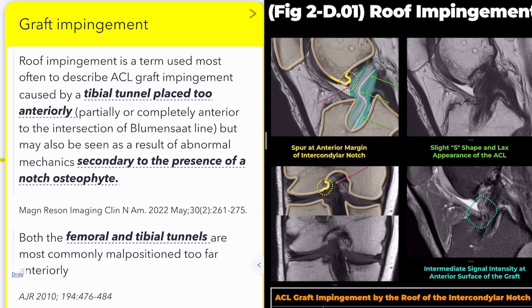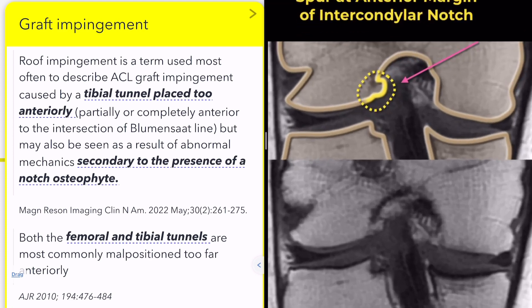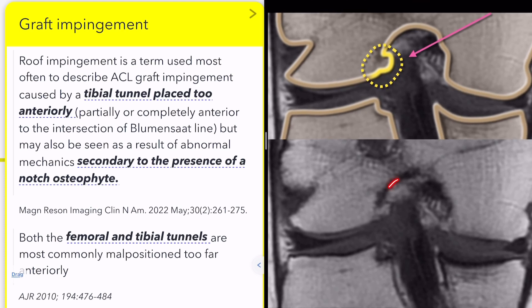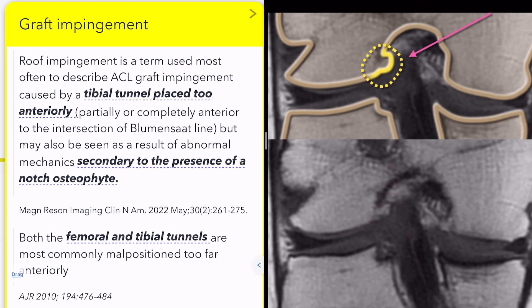Additionally, osteophytes at the intercondylar notch level can cause impingement against the graft. On a coronal image at this level, you may see a spur adjacent to the impinged ACL graft, especially well visualized on T1-weighted sequences.